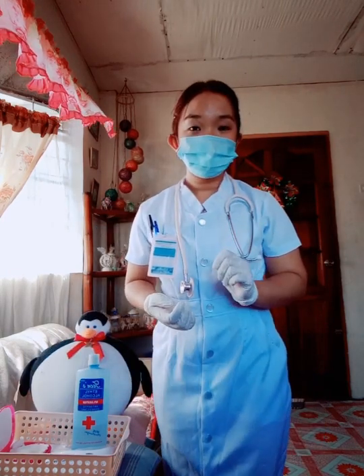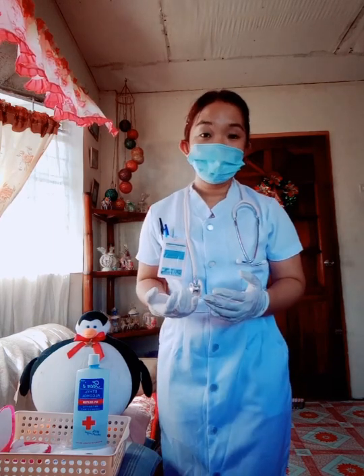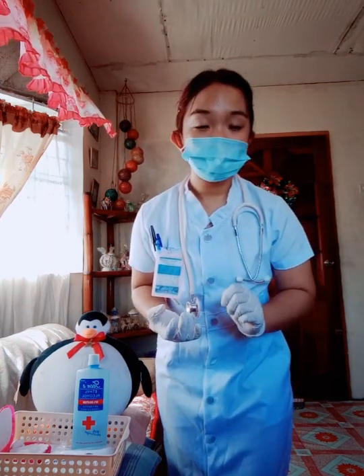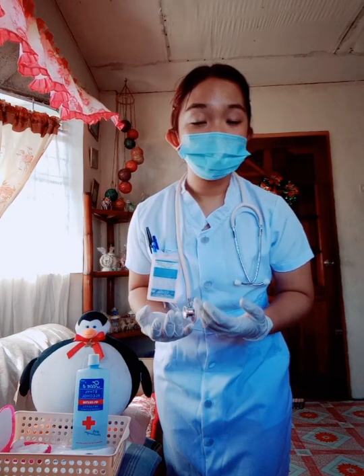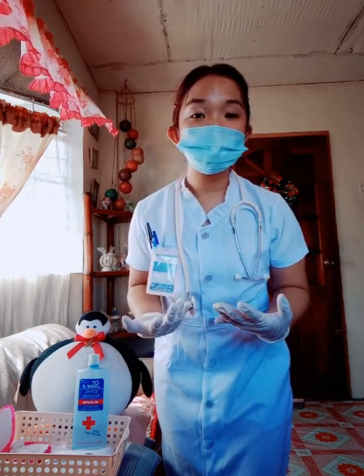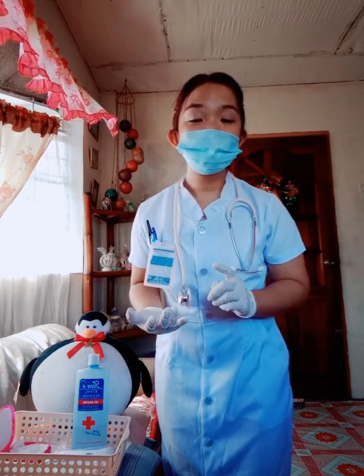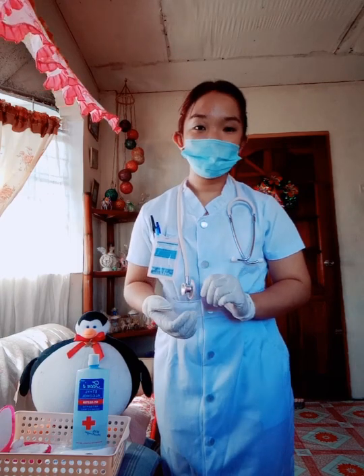The third step of the procedure is to provide for client's privacy. It is a must and important, for it's part of the right of a patient. And also we, health practitioners, must always check the area to avoid disturbances and incidents during the procedure.